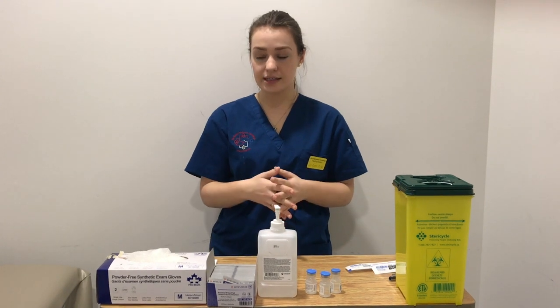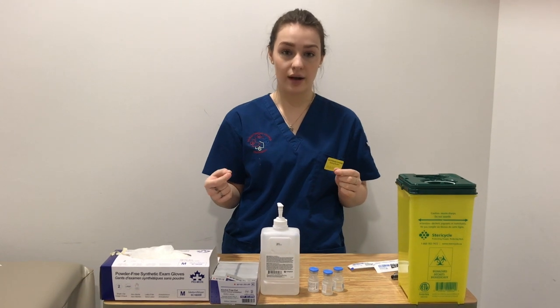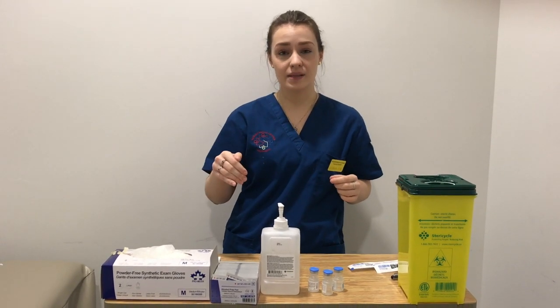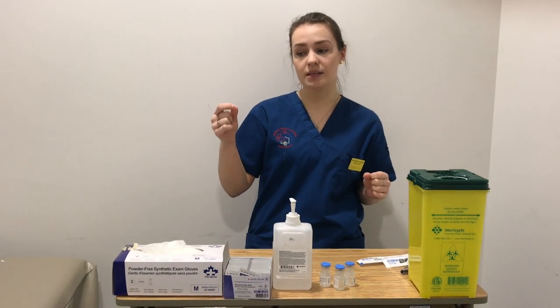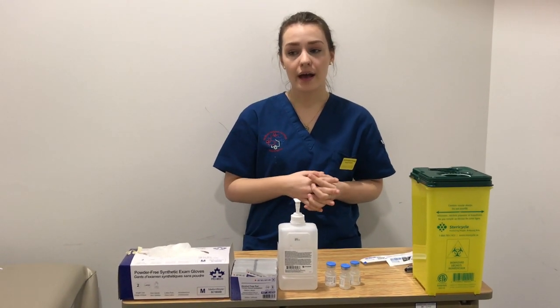So for subcutaneous injections, we don't need the needle to be too long, nor do we need the diameter of it to be too wide. So a 1/2 inch should be sufficient enough. However, for intramuscular injections, we do need a slightly longer needle length to get right into that muscle so that we're not still in the tissue. The diameter of the needle sometimes has to be bigger as well just to get through. And then for those patients who may be a little bit larger, there are also times where we might have to even go down to an 18 gauge needle.